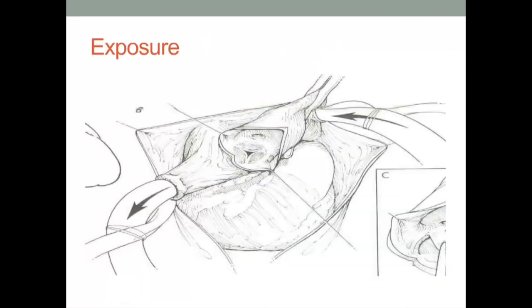Of paramount importance, regardless of any proposed technique, is exposure of the left ventricular outflow tract. In many instances, a complete division of the ascending aorta, approximately 1 centimeter above the sinotubular junction, provides excellent exposure to the aortic valve and left ventricular outflow tract. Stay sutures may be placed into the wall of the aorta to help retract tissue and appropriately identify the coronary ostia, native valve architecture, and commissures as well as the subaortic region.